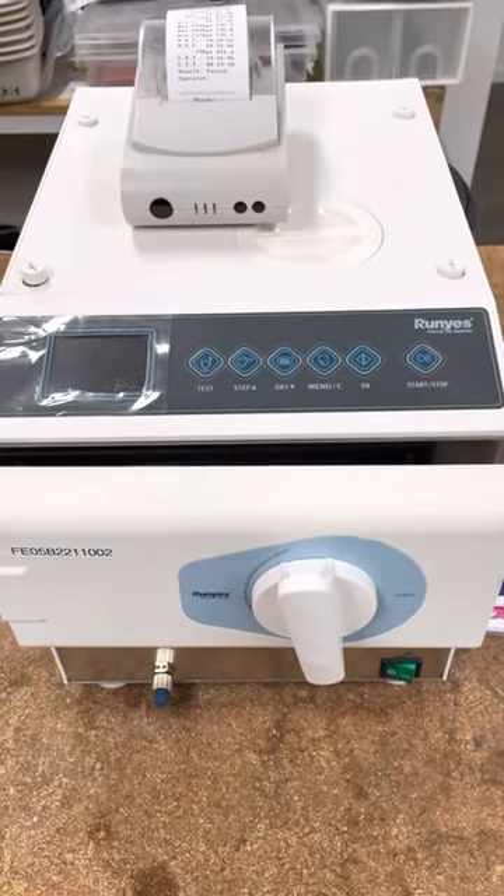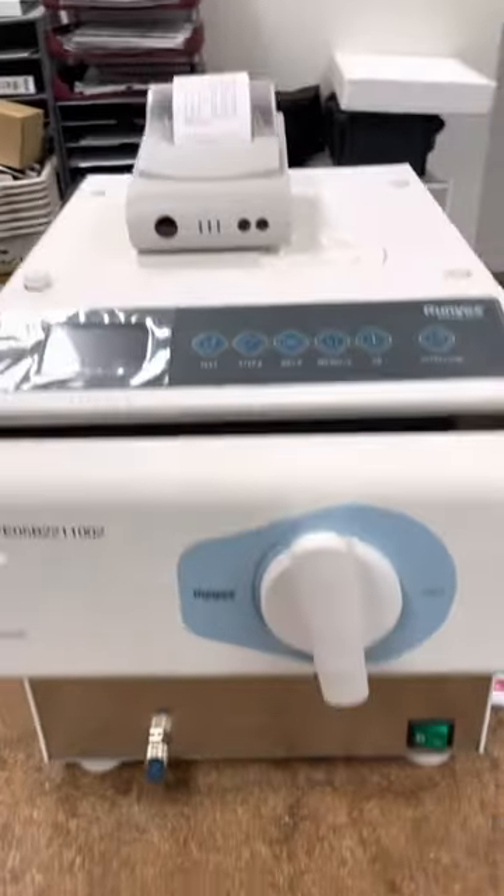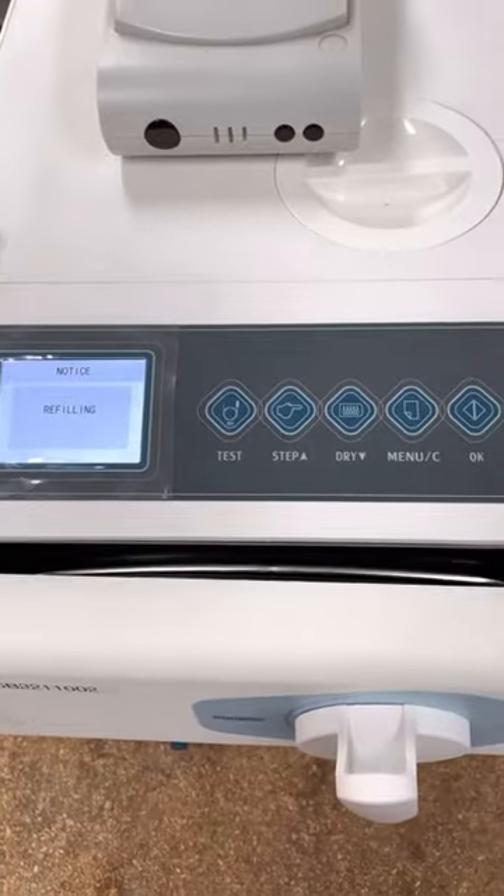Hello. This is how you use the Ranyus 5.0L Autocraft. To turn it on, it's incredibly simple — there's an on/off switch. Turn it on and the switch comes on.